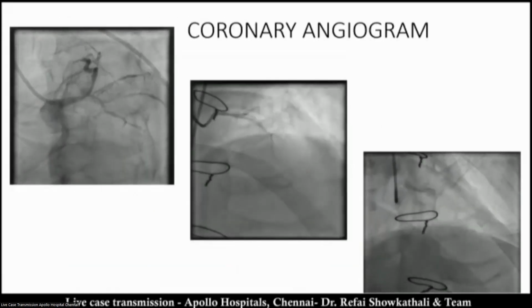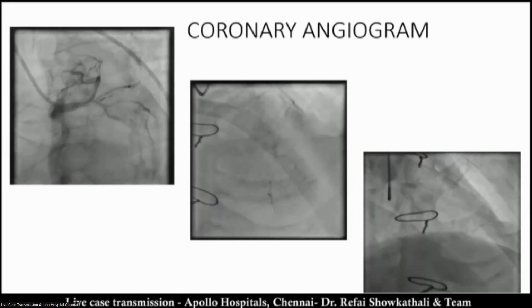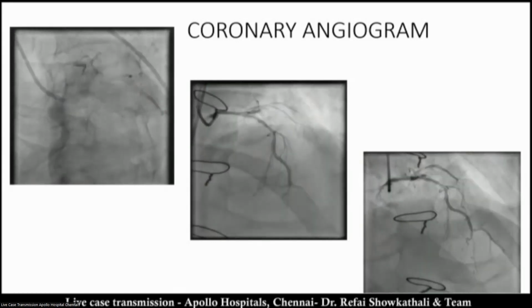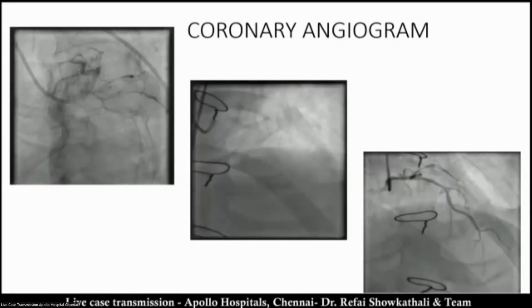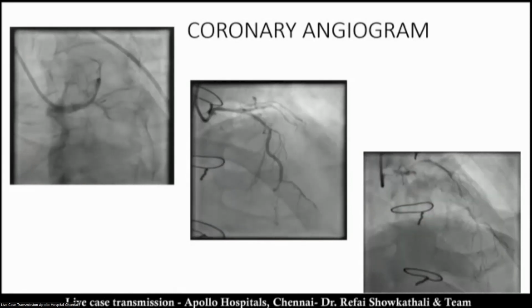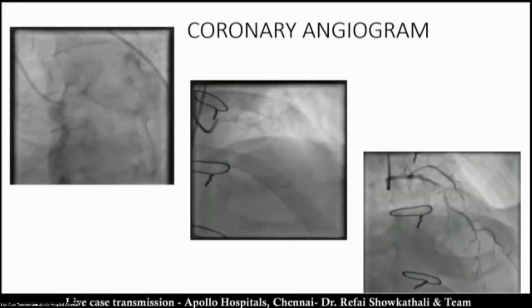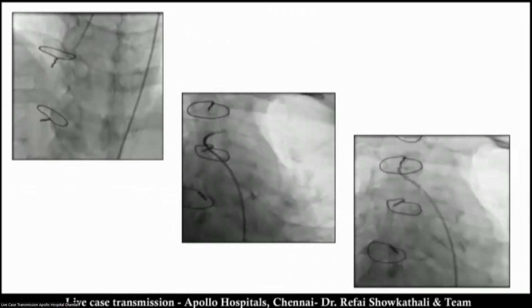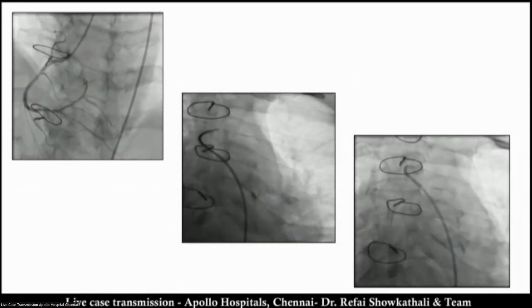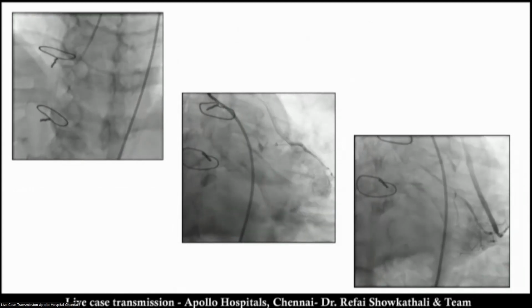So this is the coronary angiogram we did 3 days ago. The LAO caudal view on the left panel shows calcified distal left main and osteoproximal LAD with around 70 to 80% stenosis. Also, the proximal circ has severe disease. In the RAO cranial view, we can see a tubular atheroma extending all the way from the distal left main up to the mid LAD. The RCA seems to have only moderate disease at the distal RCA, with a focal lesion of around 60% stenosis.